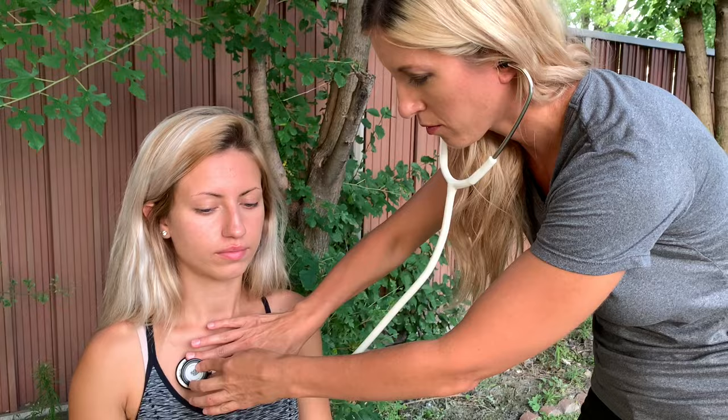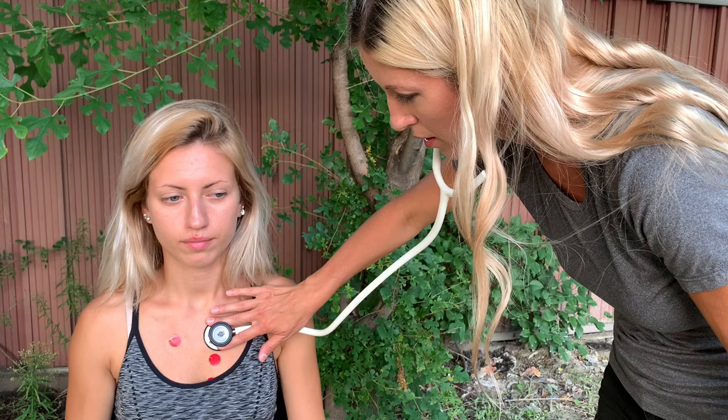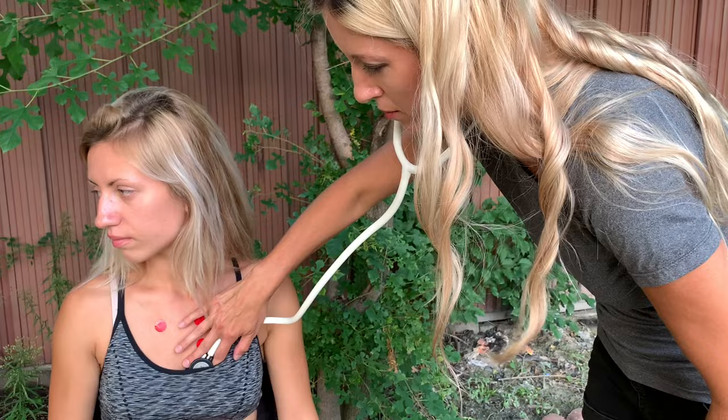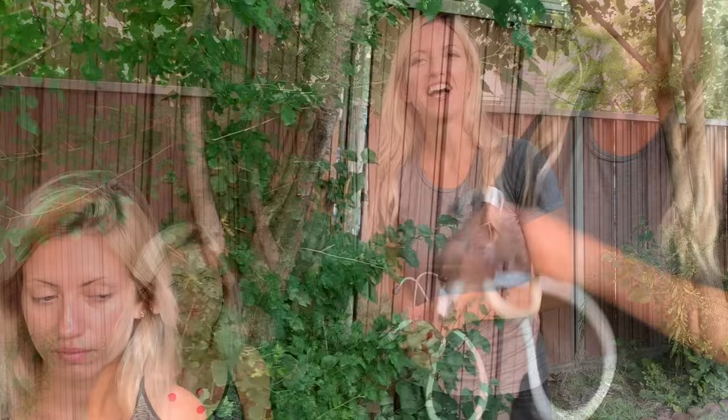You're going to listen for S1 and S2 over each point, and that sounds like lub-dub. If you hear extra heart sounds, that could be a problem. For listening to S1 and S2, you're going to use the diaphragm side of the stethoscope. You'll start at the aortic, then go to the pulmonic, then Erb's point, then tricuspid, and mitral. Those are all the landmarks for listening to heart sounds.